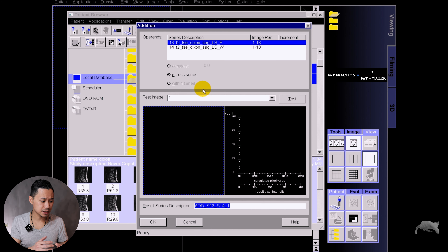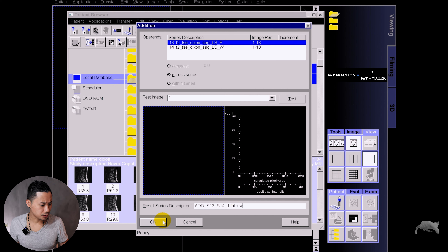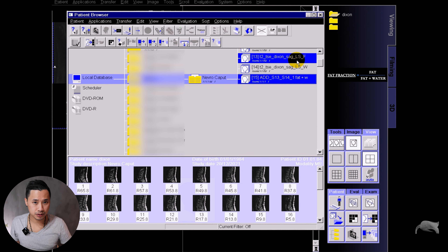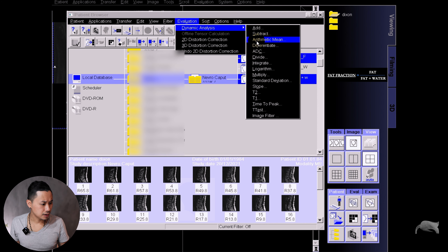We're going to mark fat and water, go to Evaluation, then Dynamic Analysis, and then Add — so this means you're adding fat and water together. It says here: add sequence 13 and sequence 14. I never erase this information because if I erase it I don't know which sequences I put together, so I keep it as a backup. I'm just going to rename it here.